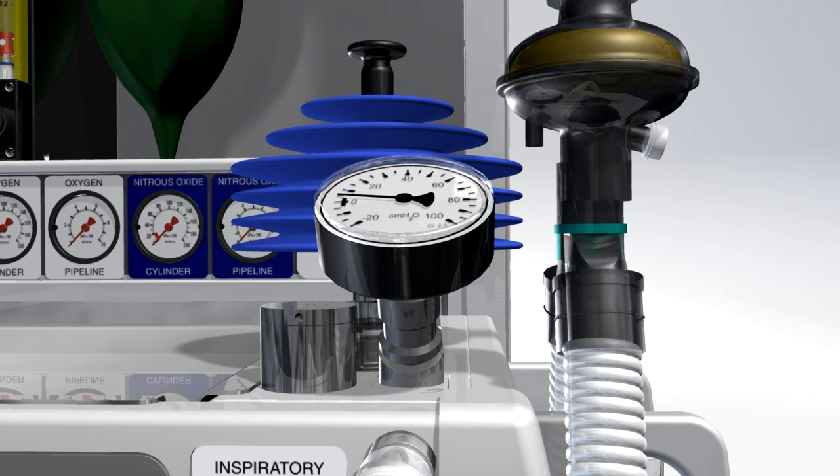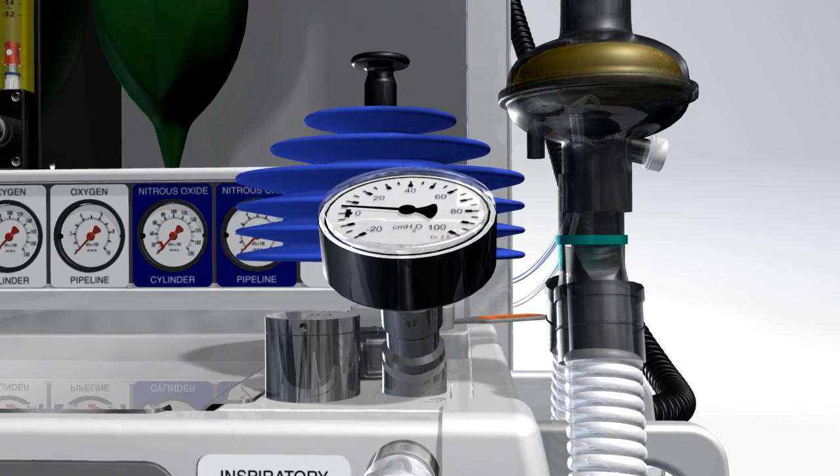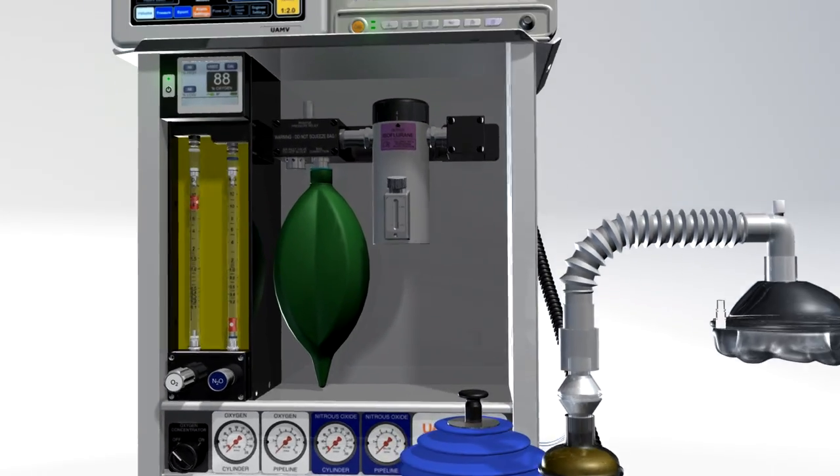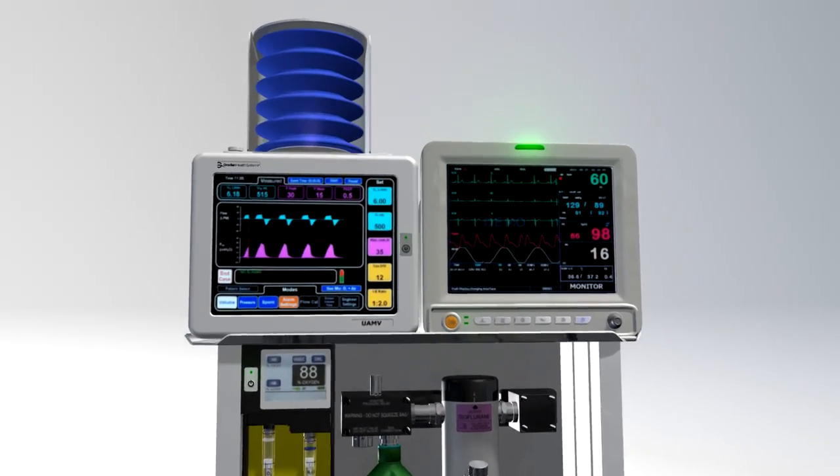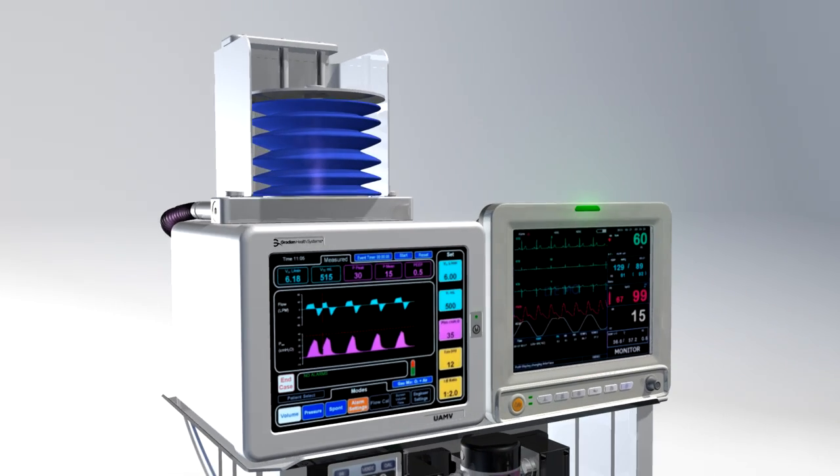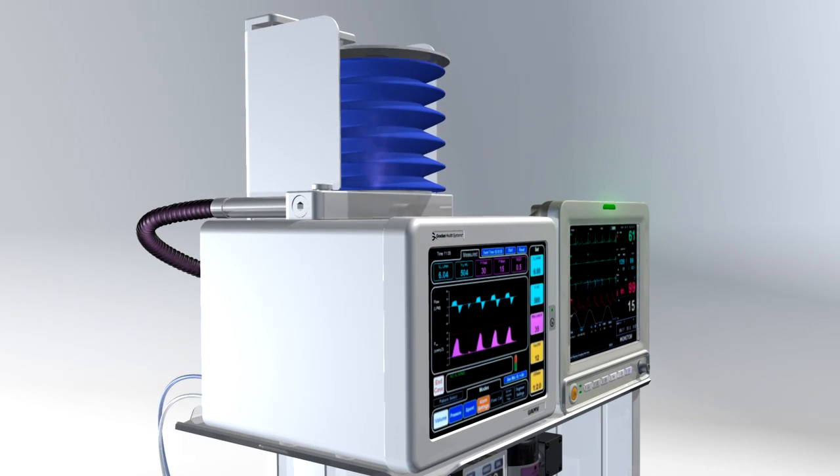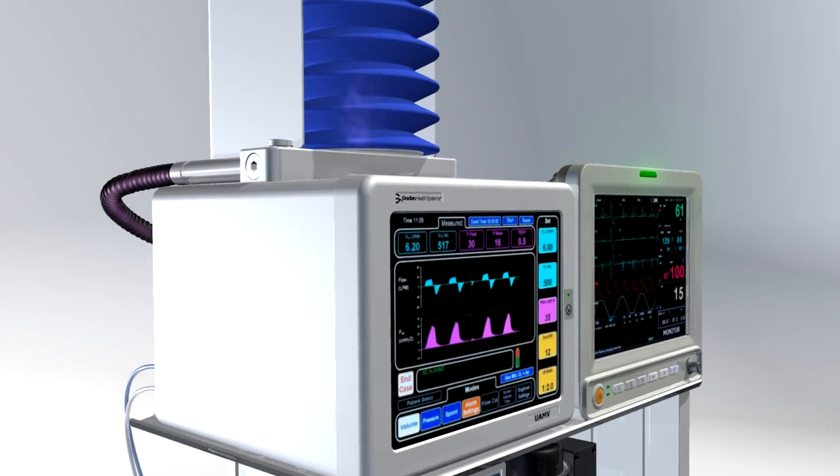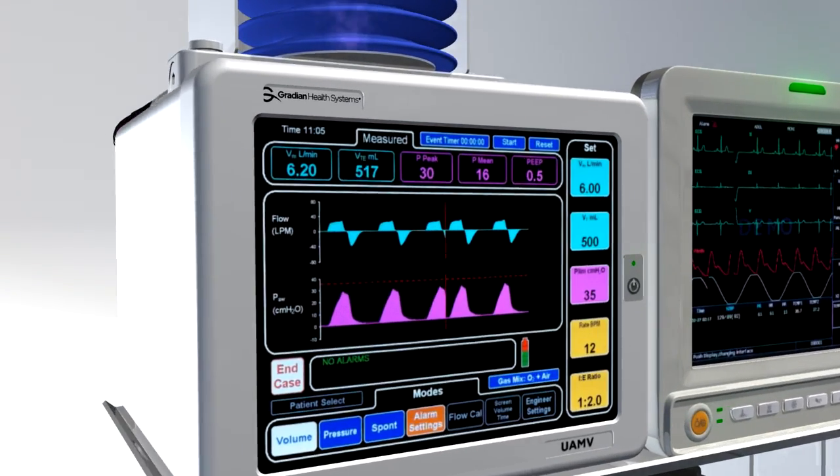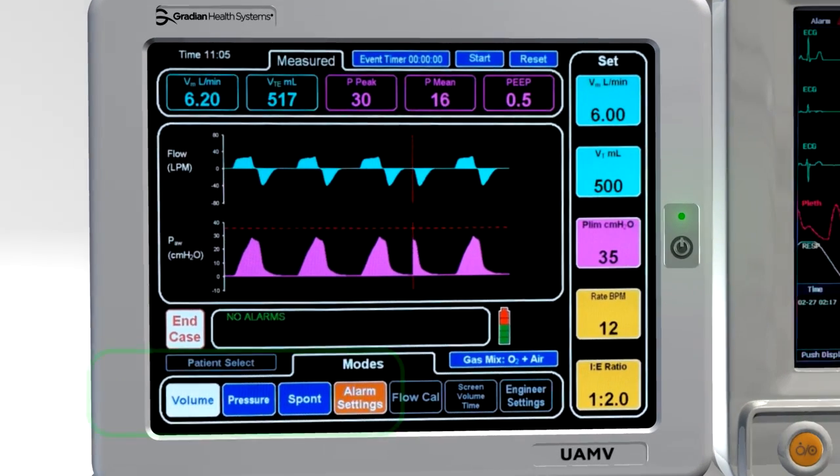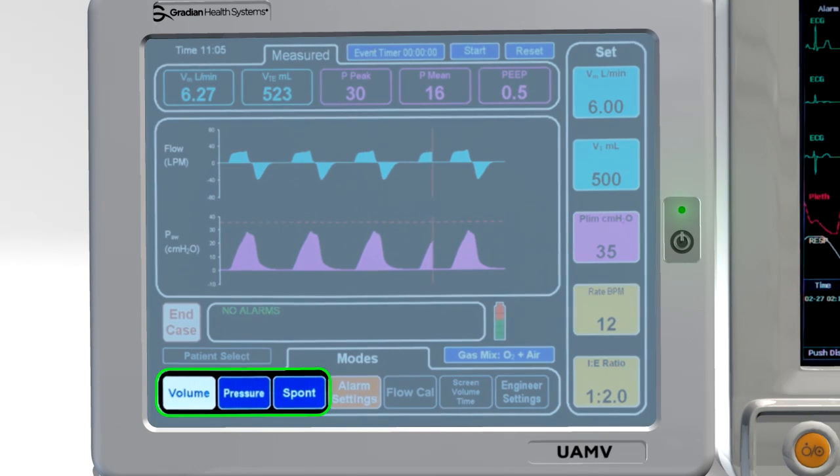The optional ventilator provides automatic IPPV. It is electrically driven and does not require compressed gas. Internal batteries provide up to six hours of backup operation. The UAM ventilator operates in volume control and pressure control modes. During spontaneous breathing and manual IPPV, it will display pressure and flow readings.